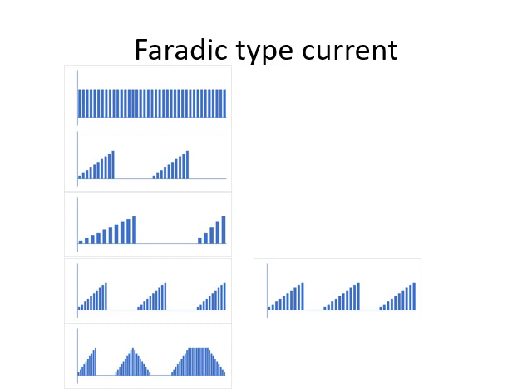The next one is a triangular pulse, and the next one is a trapezoidal pulse. In the trapezoidal pulse, there is progressive rise in the intensity. The peak intensity remains continuous for a certain number of pulses, followed by surging down, so that the intensity becomes 0. In triangular pulse, there is slow rise and immediately followed by slow drop in the consequent pulses intensity.